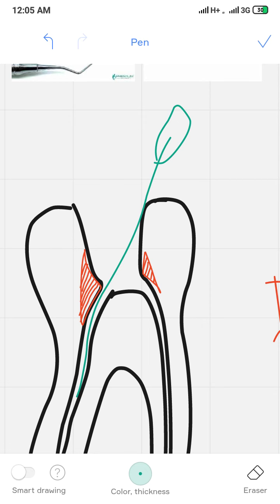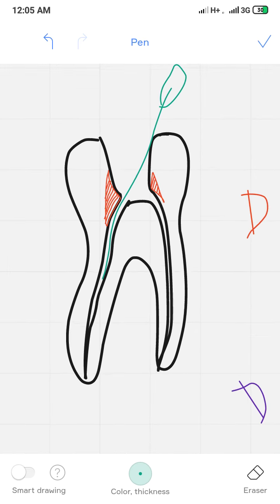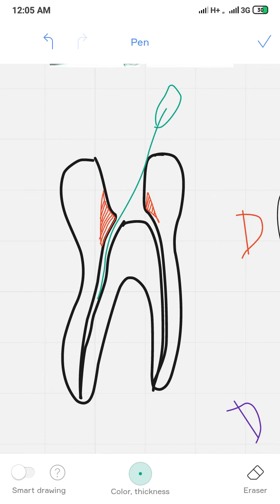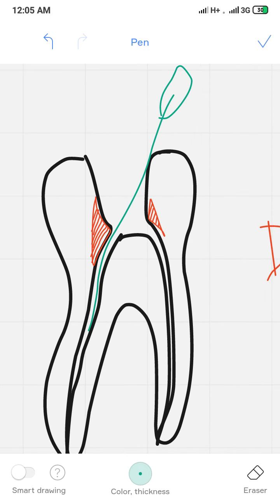That is a problem because this is not the only angulation. There can be further curvature along the canal, but an endodontic file cannot really work too many curves at a time. It can better handle one or two curves at a time. At best, better to work one. So it will be a good idea to remove this triangle so that we can get a straight line access.